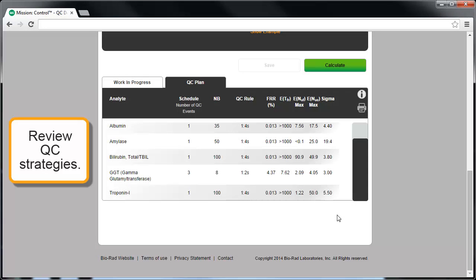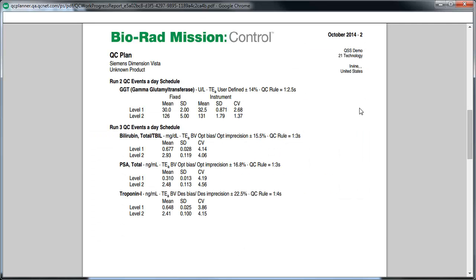We can review all of the QC strategies in the QC Plan by clicking on the printer symbol. The QC Plan summary lists relevant information about each analyte with a QC strategy that has been accepted into the QC Plan.